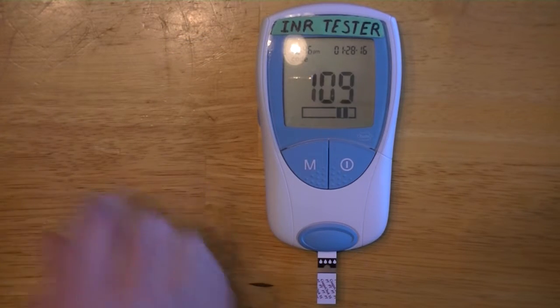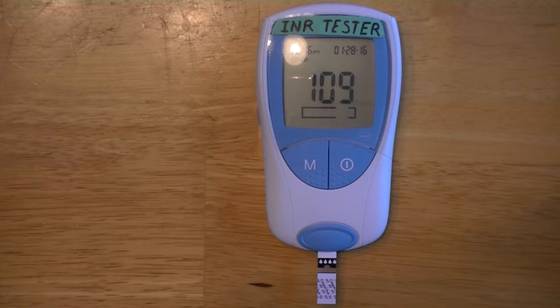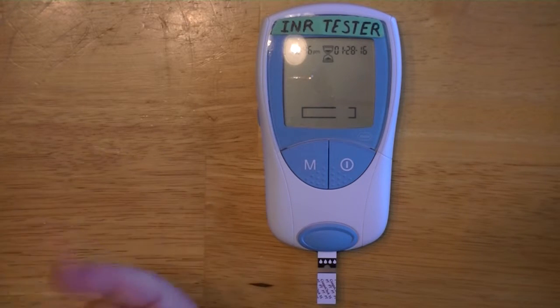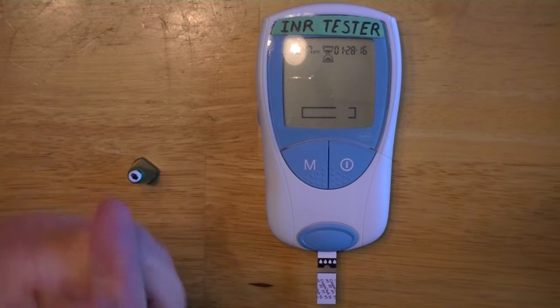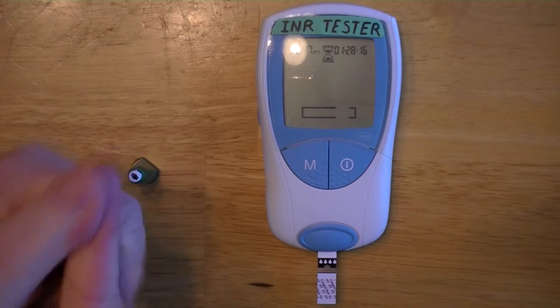You then push the button to get your machine to warm up. At this point you can take your lancet and twist off the top — if that's the one you choose to use, which I do, it's much easier for me. Then you milk the finger you're going to use until the machine gives you your countdown signal.